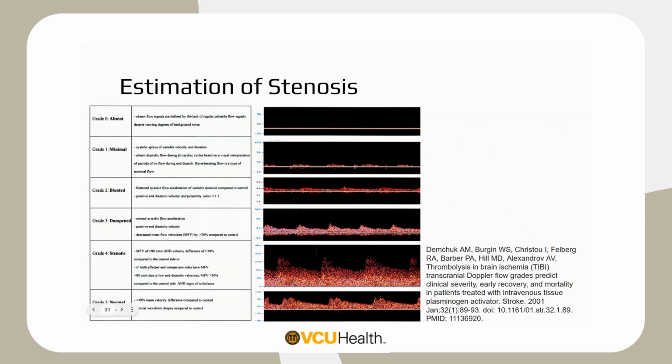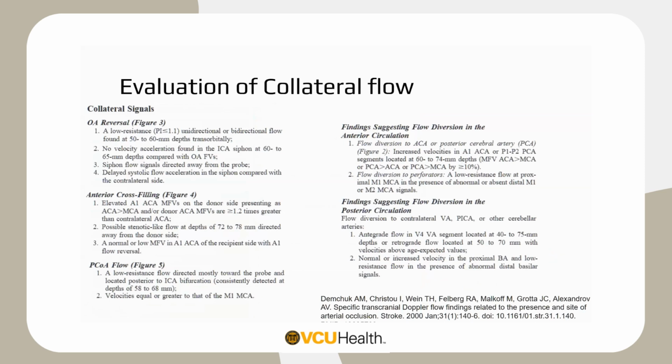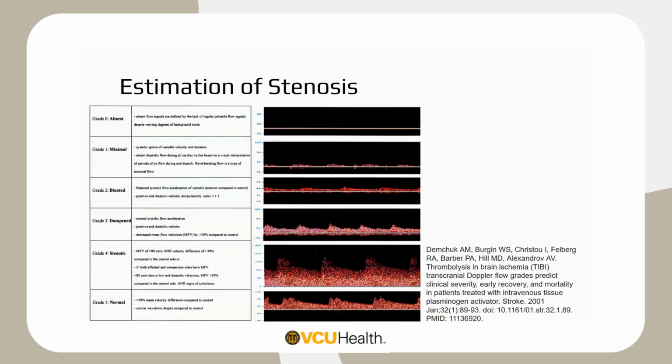This is looking at recanalization after IV thrombolysis, but this grading has been used in other settings as well, not just post thrombolysis, to look at the flow through a vessel and give a characterization of the vessel flow. So that's essentially fairly well-established methods of characterizing stenosis using TCD.